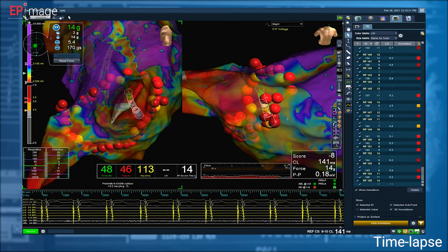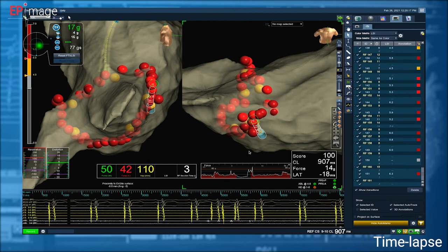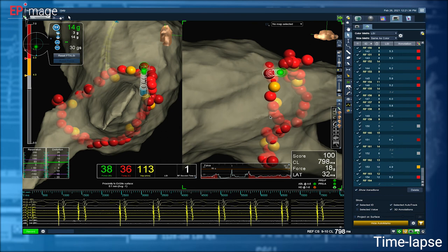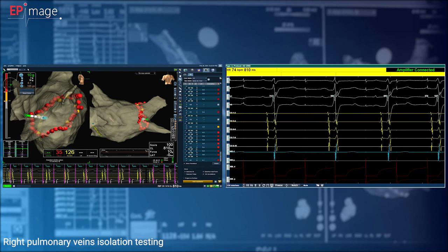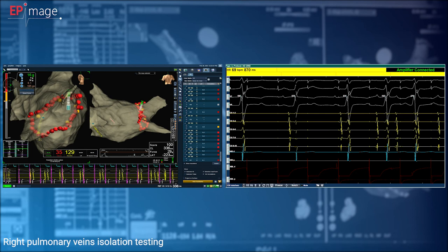What you see at the moment, we just moved the bar of the voltage map upwards just to see the regions of higher bipolar amplitude. It is extra information I sometimes use just to be sure if the region is thinner or thicker. That's why I'm more focused on using longer applications sometimes if the region is thicker, just to be sure that I burn it through.